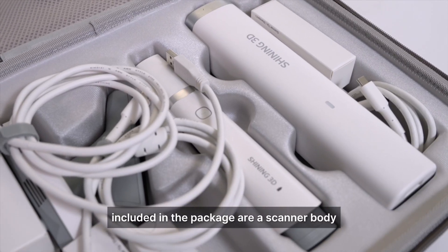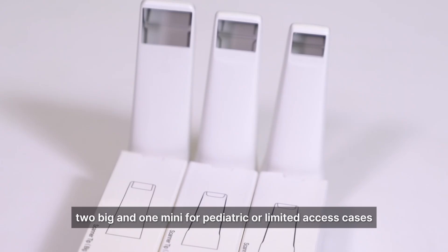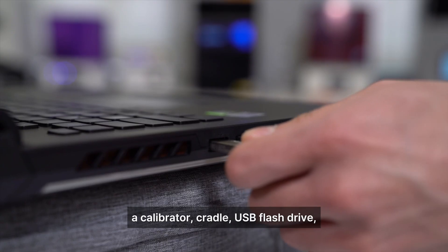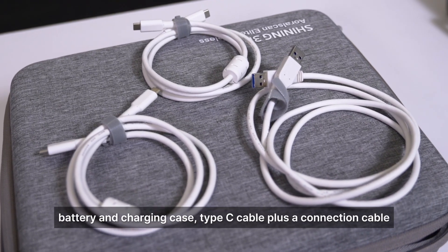Included in the package are a scanner body, a set of 6 scanning tips — 3 standard, 2 big, and 1 mini for pediatric or limited access cases — a calibrator, cradle, USB flash drive, battery, and charging case Type-C cable plus a connection cable.